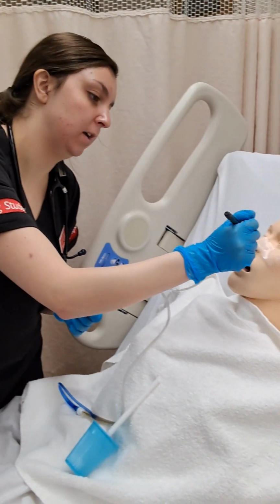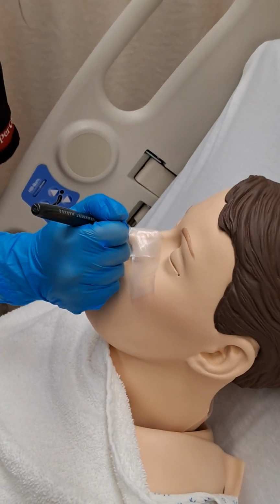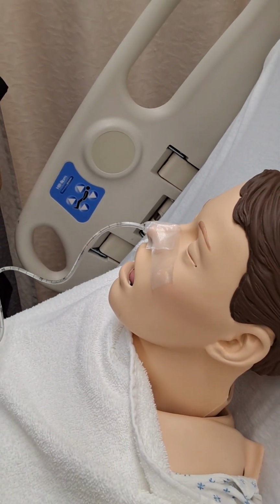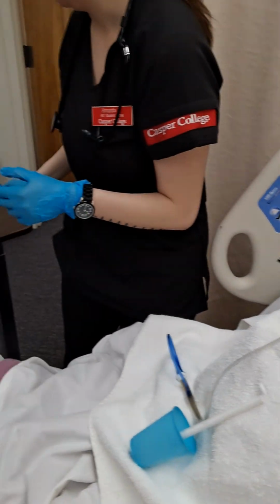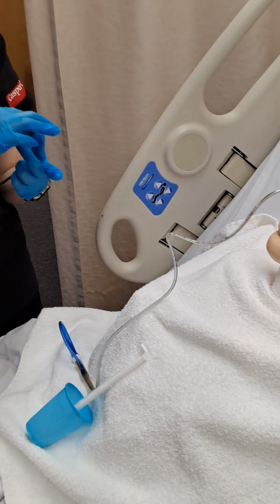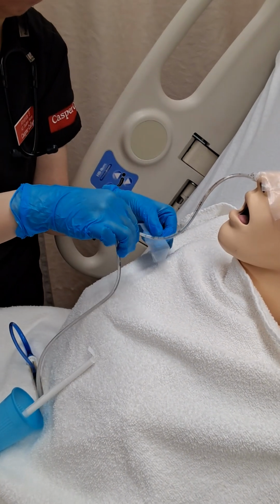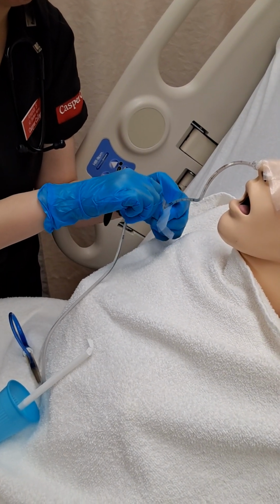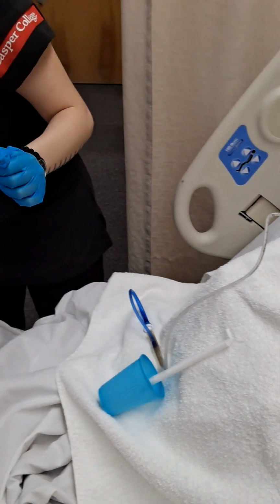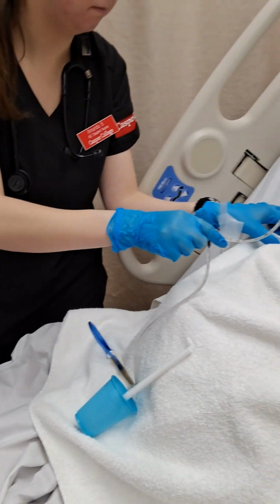Okay, now I'm going to mark it at the nose area. Now I'm going to pin it to his gown. I'm going to use a safety pin.